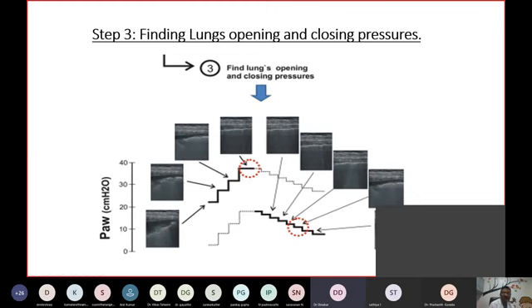Okay, fine. So this is your opening pressure, or this is where your lung is recruited. Once your lung is recruited, you need to do a titration downwards to get a PEEP where you are going to get good oxygenation. So from here you are going to decrease your PEEP by 2 centimeters, keep it for 2 minutes and get an ultrasound done in that area.